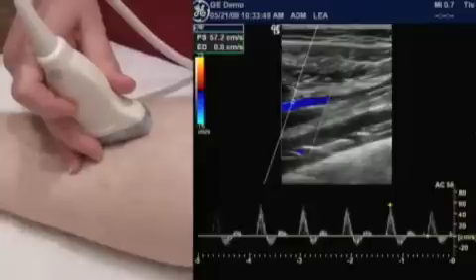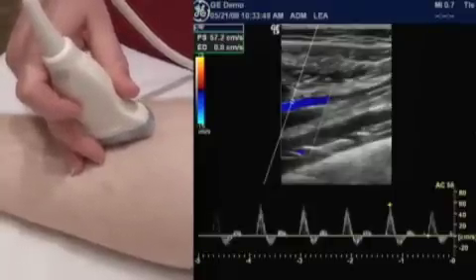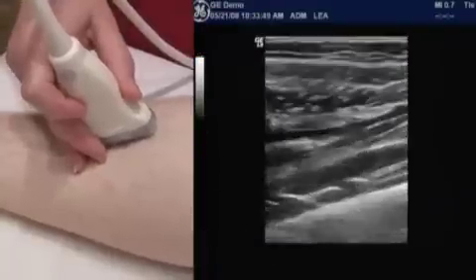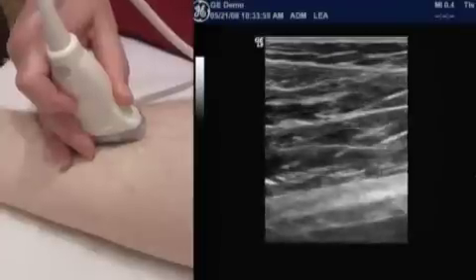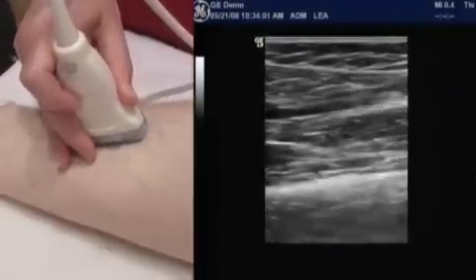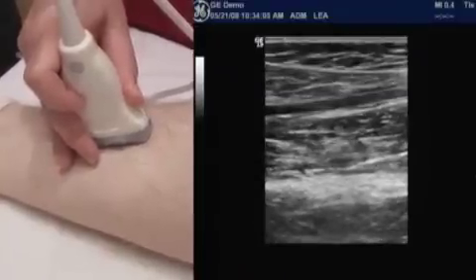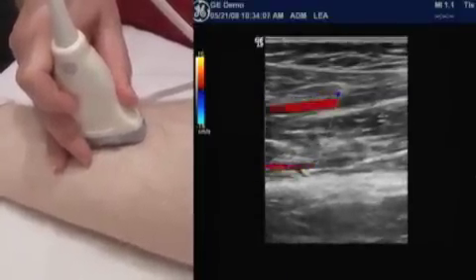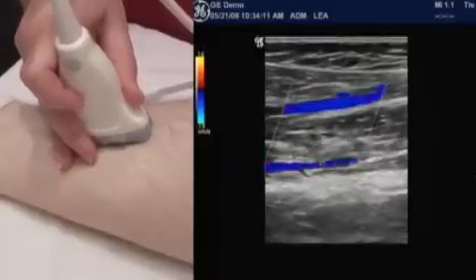And we see again this triphasic flow pattern peaking out at around 58, 57, so that's perfectly fine. Now you can follow it in grayscale, which is fine. You do want to assess it and make sure there's no plaque or no calcification, but you can see beautiful color filling, and our subject today has wonderful anatomy.